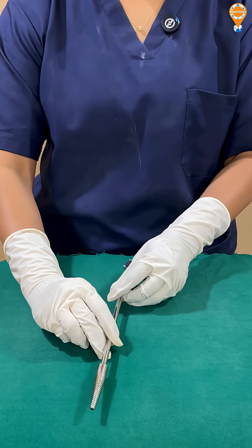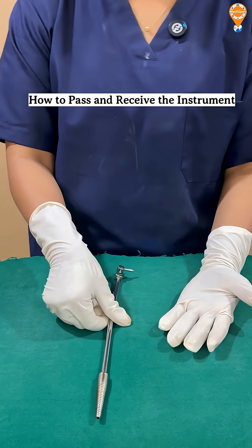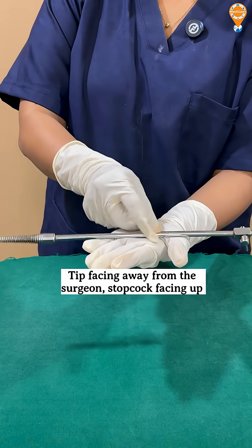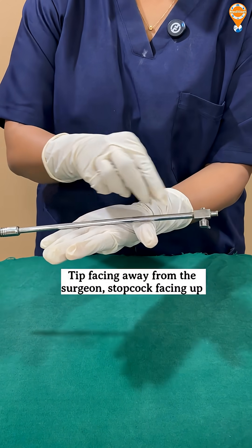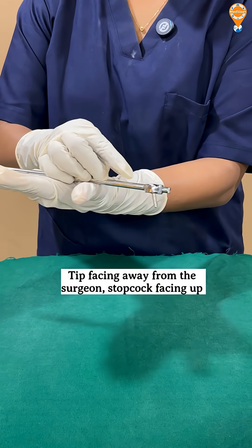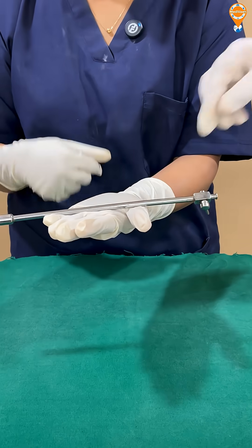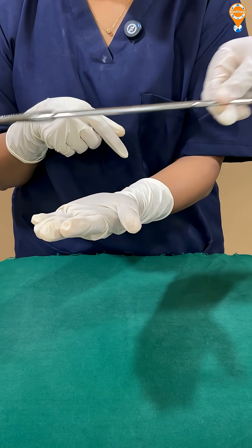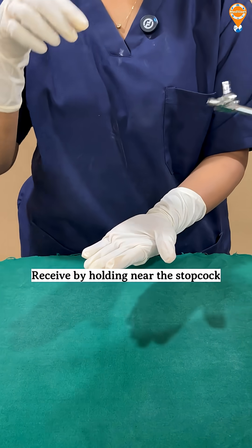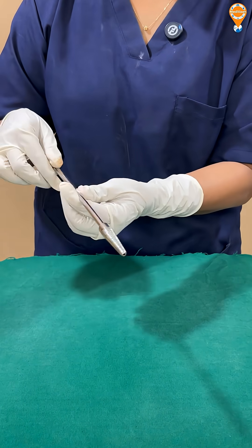While passing this to the surgeon, it's like any other instrument — hold it with the tip facing away from the surgeon. You can hold it with the stopcock facing upwards. The surgeon will pick it directly, holding near the stopcock. While receiving it back from the surgeon, hold near the stopcock and receive it, then send it for sterilization.